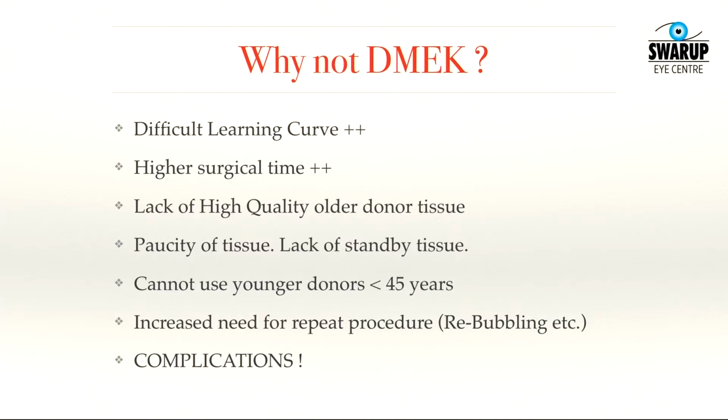It's a difficult surgery. It's difficult to learn, and it takes longer time, especially in the initial stages. So if you're a person whose surgical time is of paramount importance and you need to finish in a hurry, you'll always try to defer doing a DMEK. If you have an option to do a DSEK, you'll try to do DSEK. So that's what happens to all surgeons who move from DSEK to DMEK. DSEK is so quick, and once you've gone through the learning curve, it really doesn't take more than 10 minutes. So DMEK does take time, especially if you have a little bit of a problem.